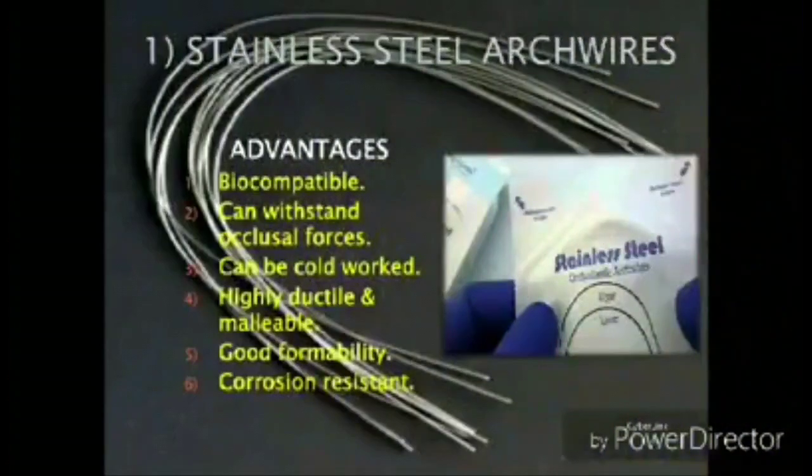Talking about the advantages of stainless steel archwire, first, it is a biocompatible alloy. Secondly, it has the capability to withstand the high occlusal forces due to its high stiffness. The third advantage is that it can be cold worked without the risk of fracture.